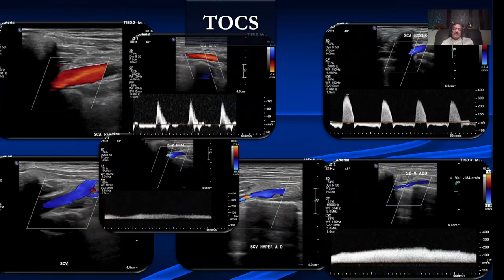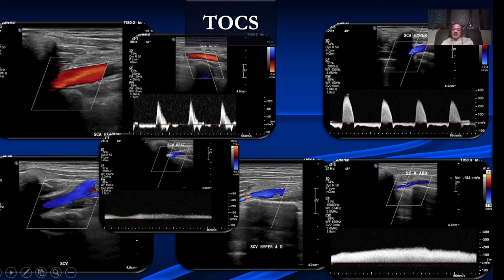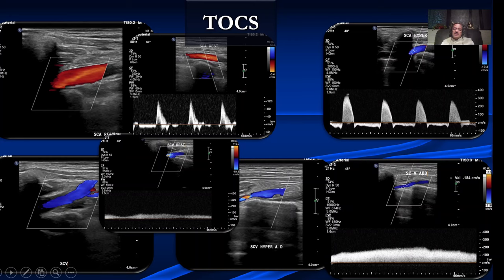Here is a patient who had thoracic outlet symptoms. The subclavian artery at rest has a velocity of about 80 cm/s. After the Roos test, the velocity increases to about 300 cm/s, telling us the artery is narrowed under provocation. Looking at the vein — a normal subclavian vein at rest — after the hyperabduction and hyperextension maneuver, there is narrowing of the subclavian vein with an increase in velocity. This is typical of thoracic outlet syndrome. In fact, Dr. Aju Wadhwa from Hinduja and I were the first to describe venous changes in thoracic outlet syndrome many years back.